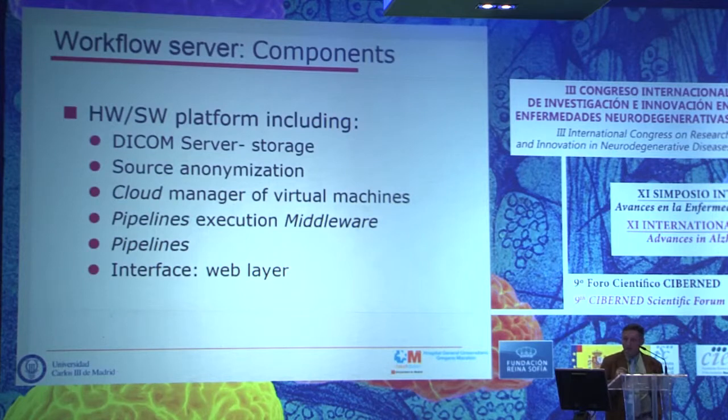What we have done in my group is to set up a system, which is the workflow server, which has several hardware and software components that include storage for the DICOM images, anonymization of the studies at the source point, and a cloud manager of virtual machines. I'm going to explain this now, along with some pipelines and one interface.